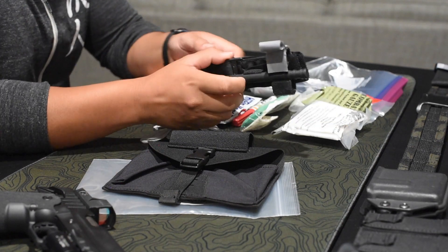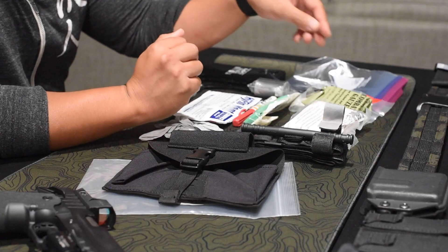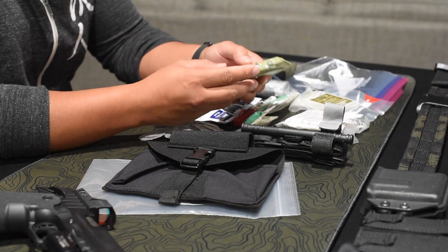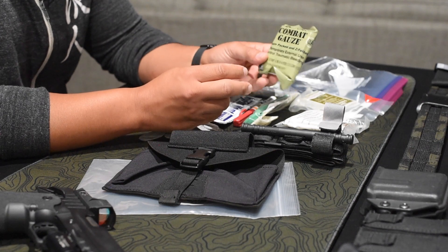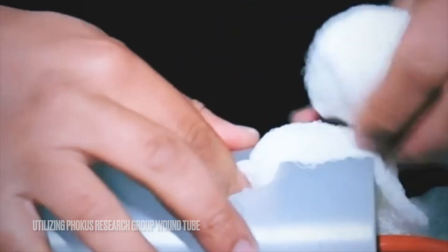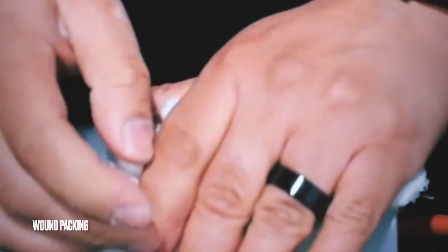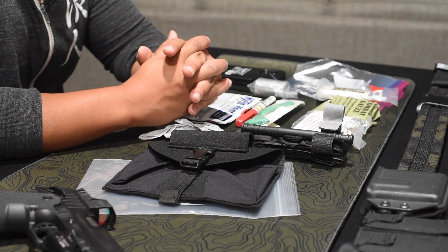We have rolled gauze, combat gauze, a compression bandage, and a North American Rescue Gen 7 CAT tourniquet. In any of my kit, you're always going to see tools to stop the bleed. The Gen 7 CAT tourniquet is already staged and ready to go. You're also going to see some sort of hemostatic agent — combat gauze, regular rolled gauze, and a compression bandage.